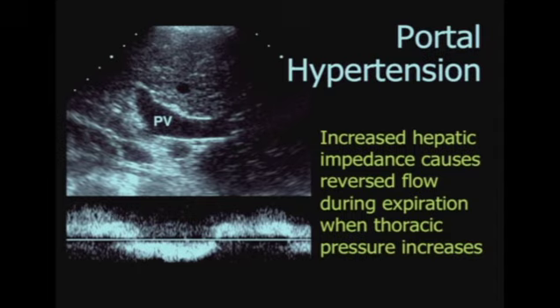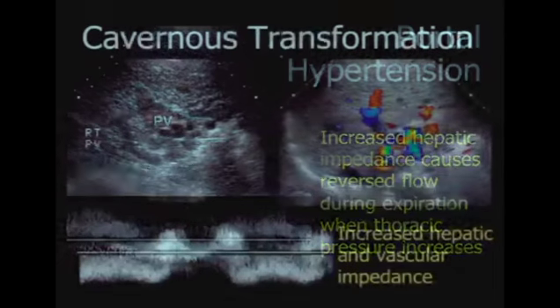There are normal measurements for adults. Given the varying sizes of children, it's not so easy to have a simple cutoff in kids, and the size of the portal vein can also be impacted by any other portosystemic shunts. But certainly when you start seeing an enlarged portal vein and to and fro flow like this, you can certainly suggest that there's portal hypertension present.